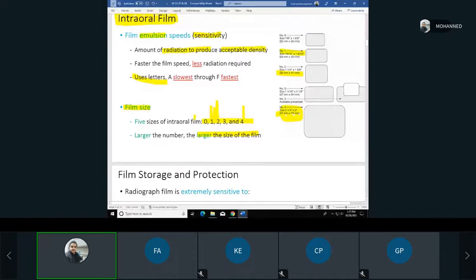It's only if a surgeon is working with it. And why do we use occlusals? To see what? Yeah, the palate, or the floor or the roof of the mouth. So, for example, if we have a tooth that is embedded in the palate, which happens, right? Some teeth would not erupt, especially the canine. So if it's embedded in the palate and the dentist wants to locate it to be able to open it up and pull it back in occlusion, they might take an occlusal x-ray.